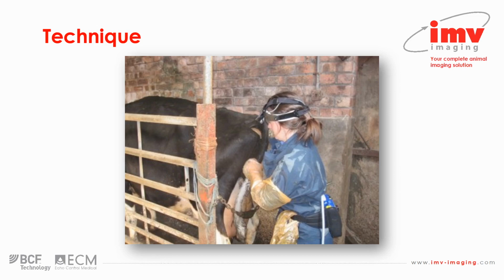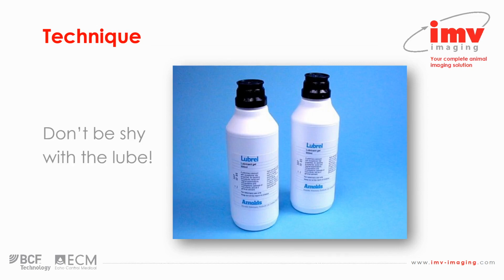One of the key things to consider when preparing to perform ultrasound, and in particular with regards to the animal's welfare, is to not be shy with the lube. These are 500ml bottles which you can get through quite quickly.